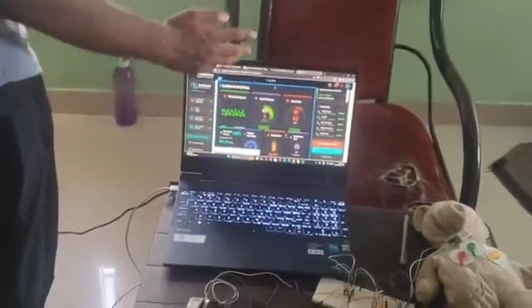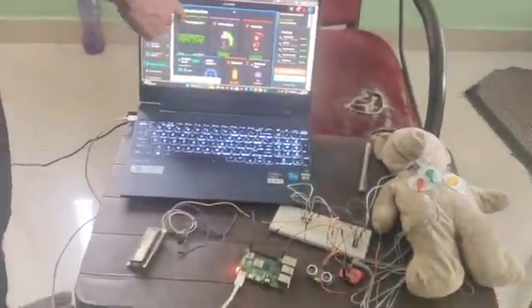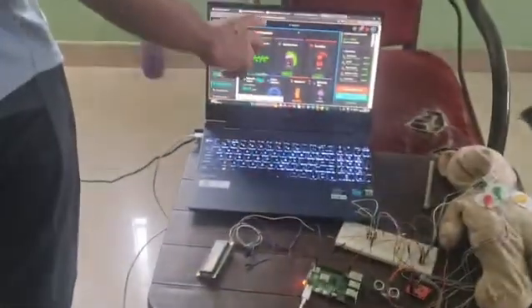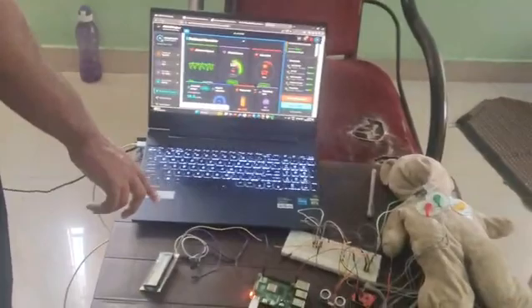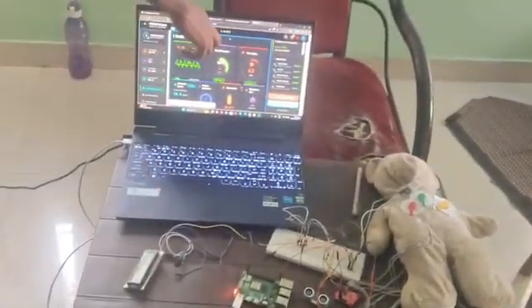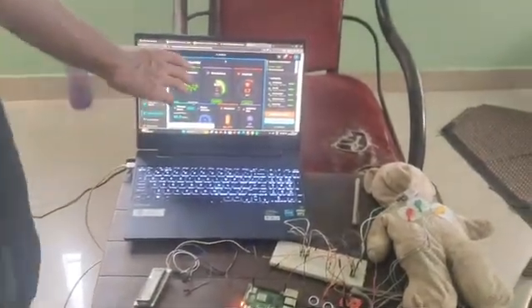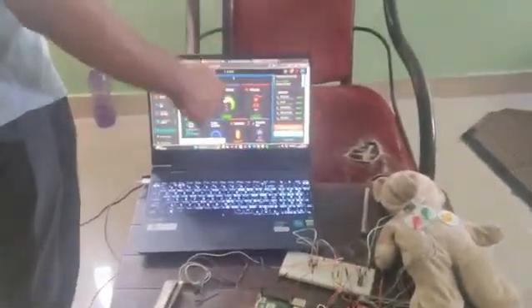In the last part of the video, we talk about the system workflow. The sensors collect the patient data. The Raspberry Pi processes the data, which is shown on the LCD and sent to the dashboard. The dashboard displays the real-time monitoring and generates alerts if abnormal. The key benefit is that the project works for completely 24-hour monitoring and instant emergency response.